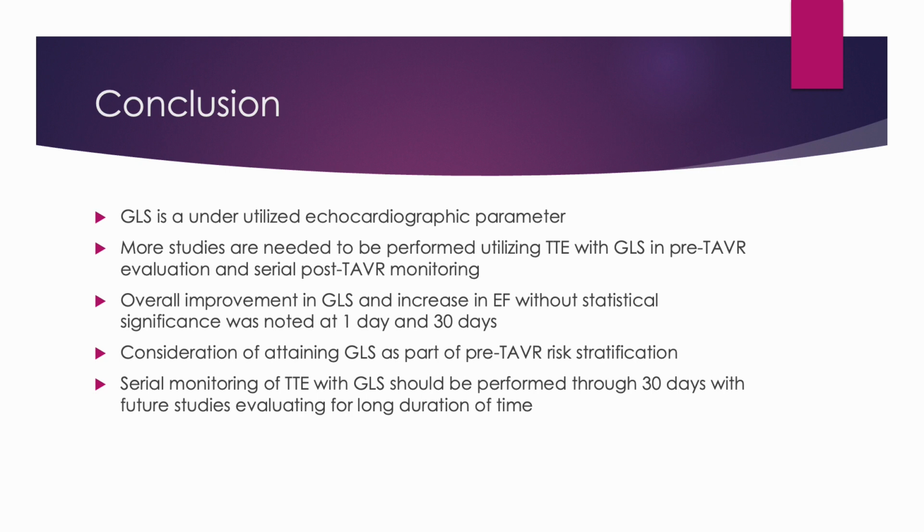In conclusion from our study, we note that more studies are needed utilizing global longitudinal strain in echocardiographic evaluation pre- and post-TAVR to assess the clinical utility of global longitudinal strain in these patients. We found that an improvement in global longitudinal strain was not statistically significant in our TAVR study population at 1-day and 30-day evaluation. Risk stratification of patients' GLS during their pre-TAVR assessment should be utilized.